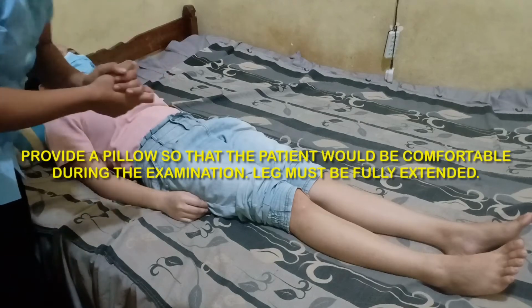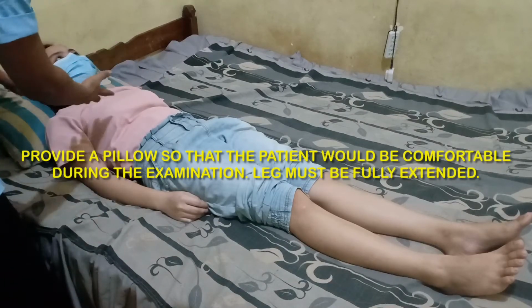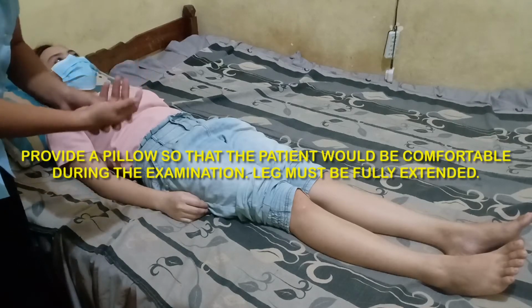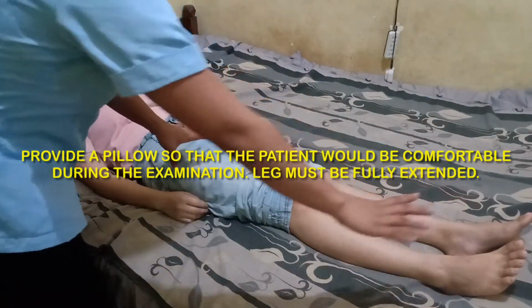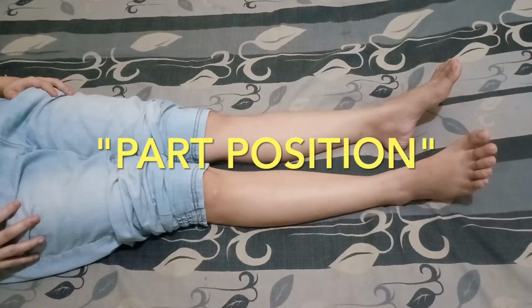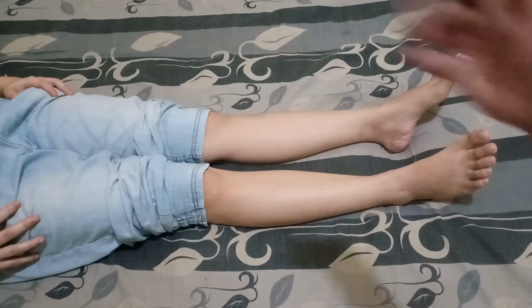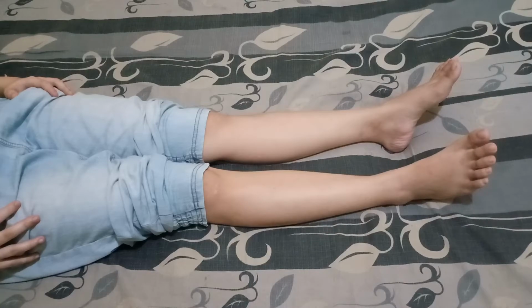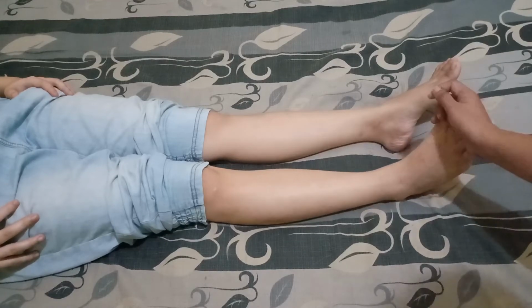The rad tech should provide a pillow to the patient's head so that during the radiographic examination, he or she would be comfortable. And also, the leg must be extended. For its part position, adjust the pelvis, the knee, and the leg of the patient into true AP with no rotation. Then, if possible, place a sandbag against the foot if needed for stabilization, and dorsiflex the foot to 90 degrees to the leg if possible, just like this.